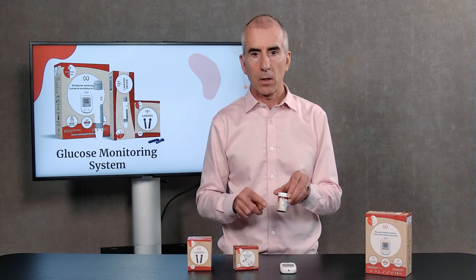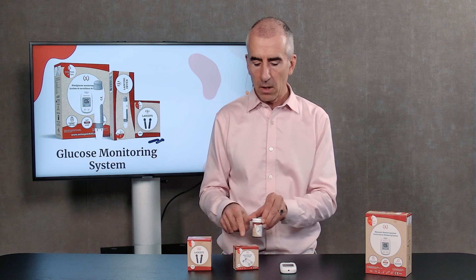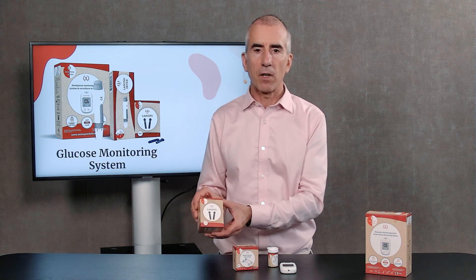If after the first 10 tests you want to do more, you can buy the test strips — these come in a pack of 50 with two little canisters, also called vials, two times 25. And you have the lancets — there are 100 lancets in a box. You can also order the control solution separately if you need it.